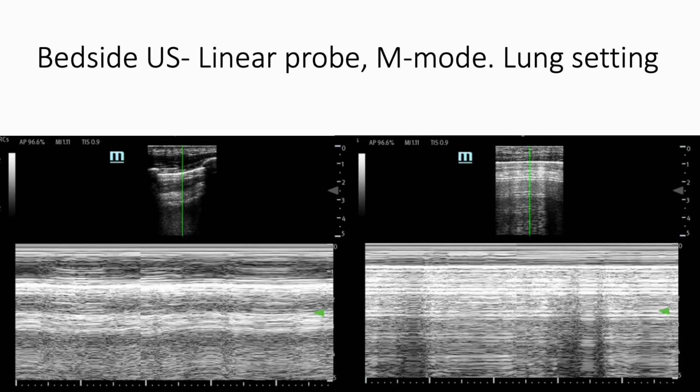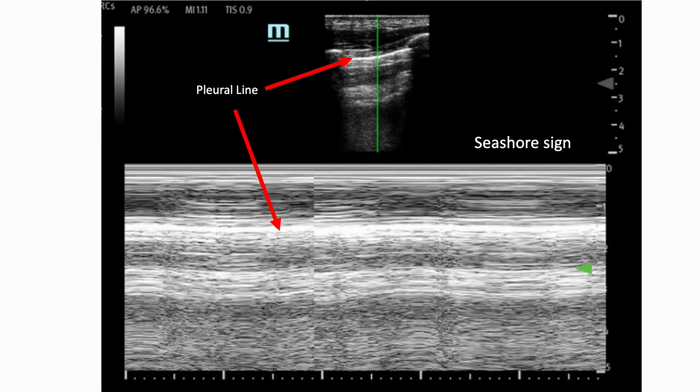So I went to this patient, brought the chest tube kit in, explained to him that he had a fairly large pneumothorax on his chest x-ray, and that we were going to put a pigtail catheter in because it had been about a month, and obviously it wasn't getting better. But before I did that, I just pulled out the ultrasound and looked at the right side of his chest in a couple different locations. And this is what I saw.